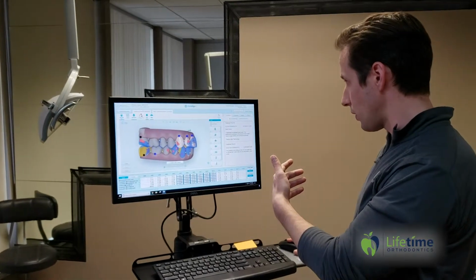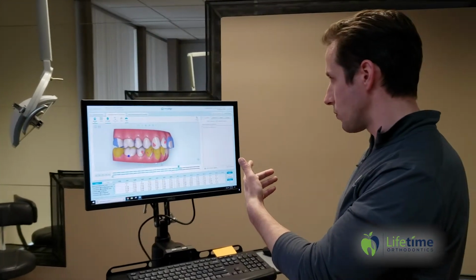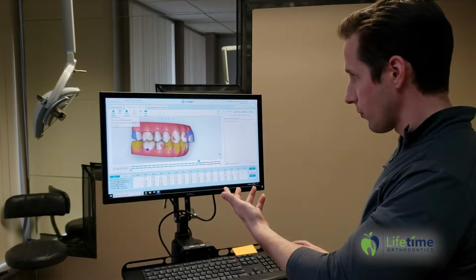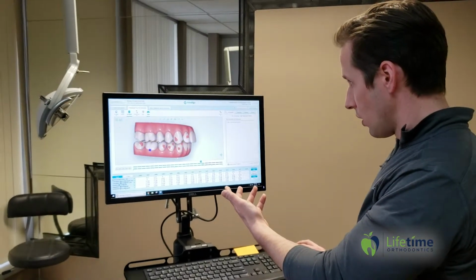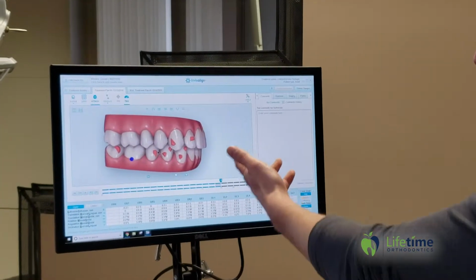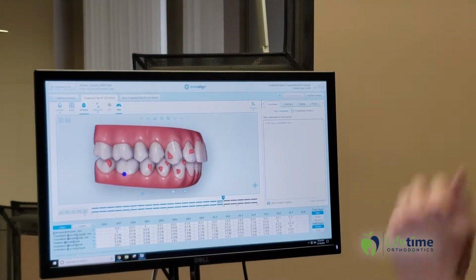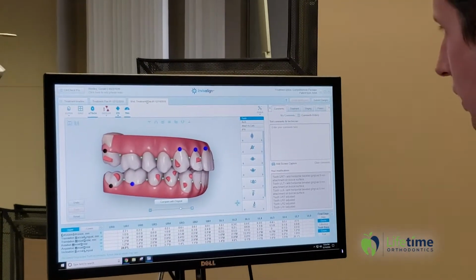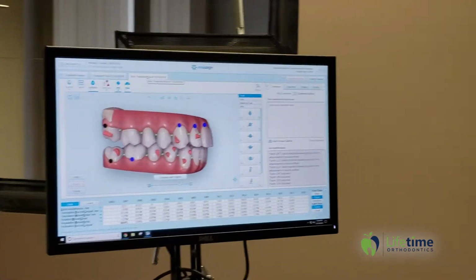So what we have here is when we get these teeth out of contact, we try to predict the bite jump, okay? Meaning, this is when these teeth don't touch, and then this will be an estimation of how my teeth will come forward once we don't have that contact. So anyways, this is my case. This is treatment plan number 1 and kind of how I'm initially going to set it up.